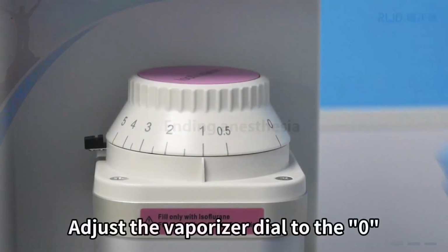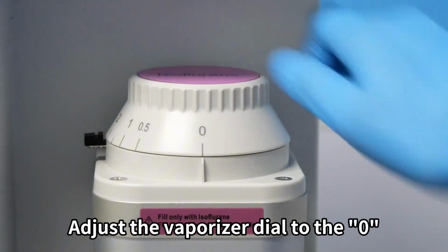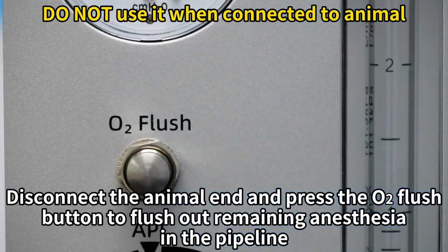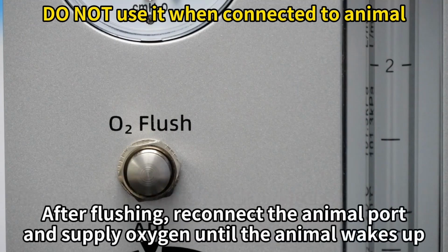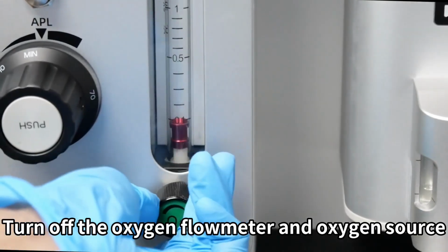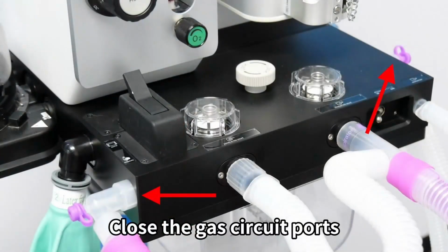Adjust the vaporizer dial to 0 when ending the anesthesia. Disconnect the animal end and press the oxygen flush button to flush out remaining anesthesia in the pipeline. After flushing, reconnect the animal port and supply oxygen until the animal wakes up. Turn off the oxygen flow meter and oxygen source. Close the gas circuit ports.